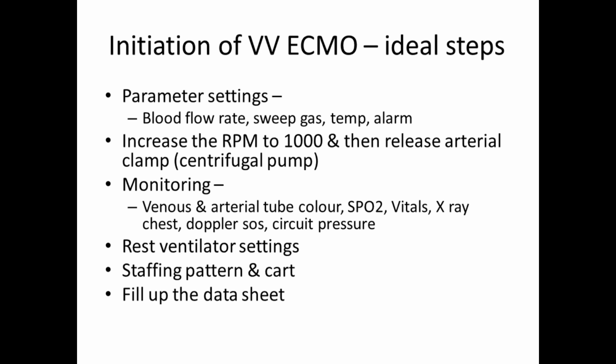It's usually a transient phenomenon which lasts hardly a minute or two, and then it recovers on its own. So what you need to do is just give some fluids, because you are replacing the blood with fluid, so you have to infuse some fluid during that time. That's it. Then get an X-ray chest done, and if required a Doppler, to confirm the position of the tubes, and monitor the circuit pressure. That is the most important thing.